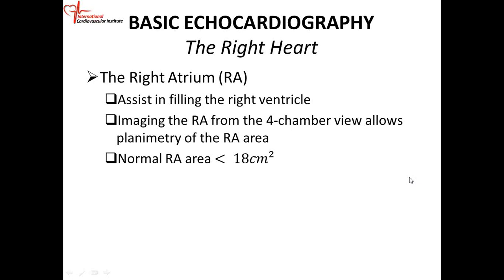That is basically the right ventricular area in diastole minus the right ventricular area in systole, divided by the area in diastole. So that's a fractional area change. We also talk about TAPSE, tricuspid annular plane systolic excursion. It's basically the longitudinal displacement of the lateral tricuspid annulus.